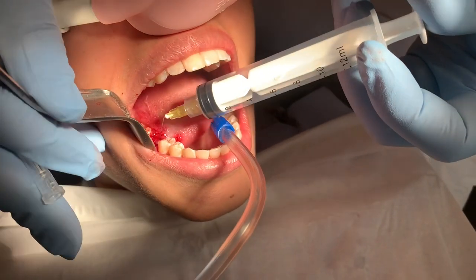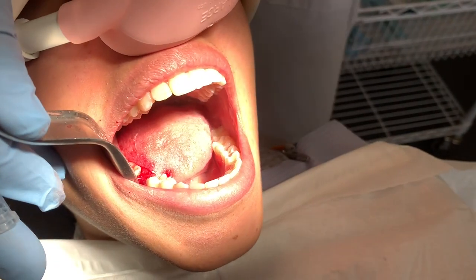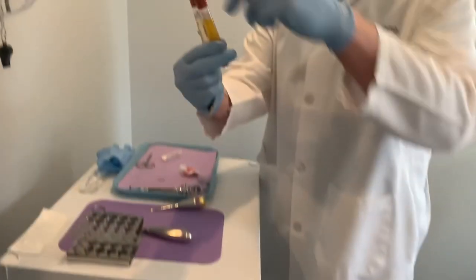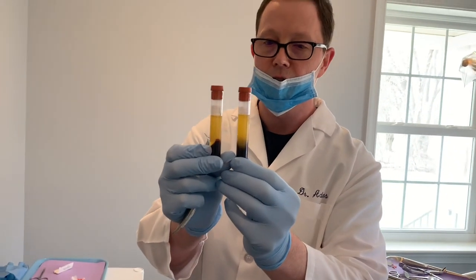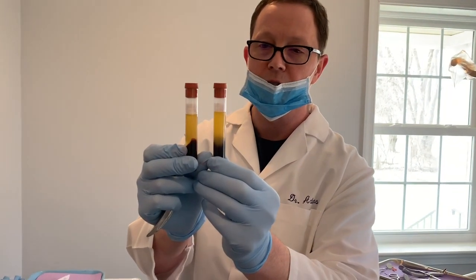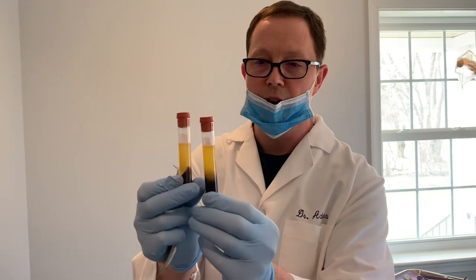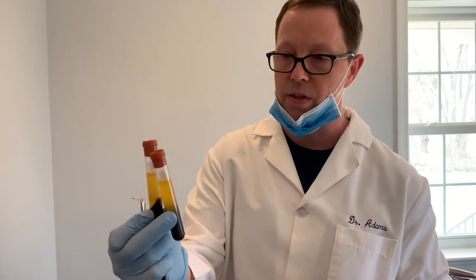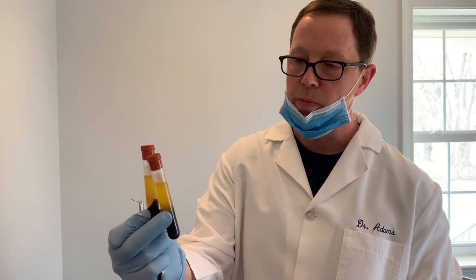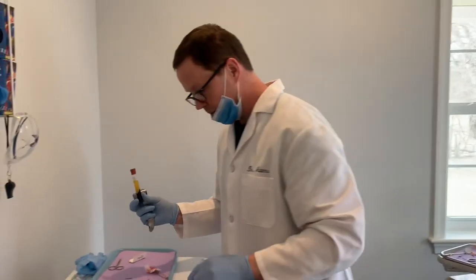And then the final thing that we do is we put the platelet-rich fibrin. These are the two vials of blood that we drew here. And you can see that there's two layers, basically, the yellow layer on top and the red layer on the bottom. The yellow layer is essentially what we're after. It's a mixture of white blood cells, platelets, fibrin. There's a lot of bone growth factors in there.